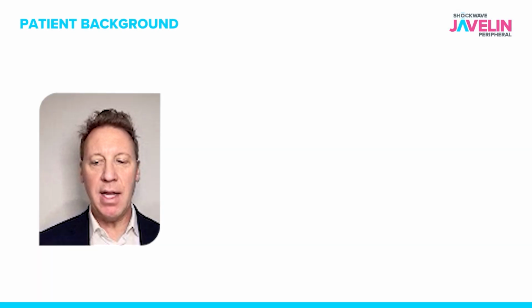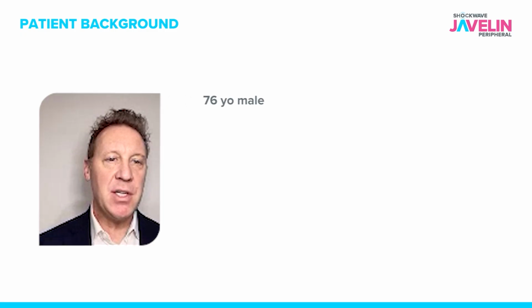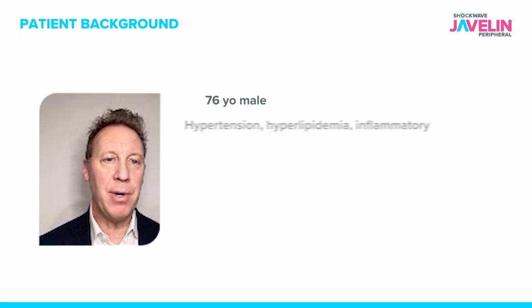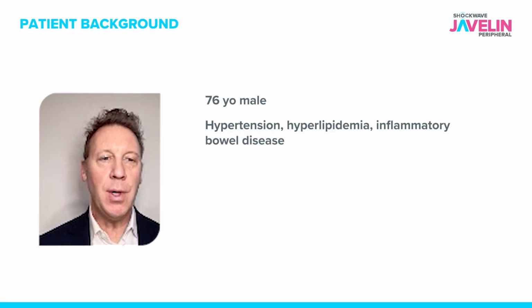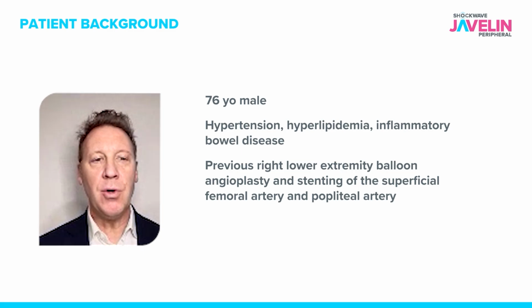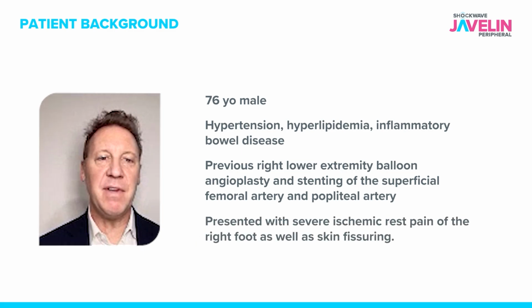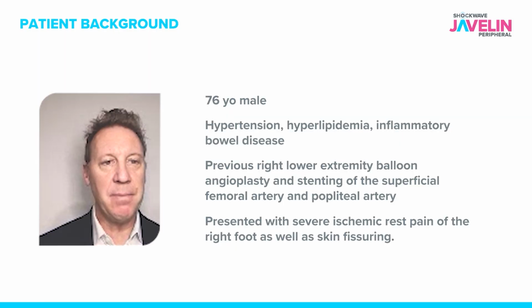So the second case I'd like to highlight is also another tibial artery case. This was a 76-year-old male with high blood pressure, high cholesterol, and inflammatory bowel disease who had previously undergone a right lower extremity balloon angioplasty and stenting at an outside hospital, who represented with severe ischemic rest pain of the right foot and some associated skin fissuring.